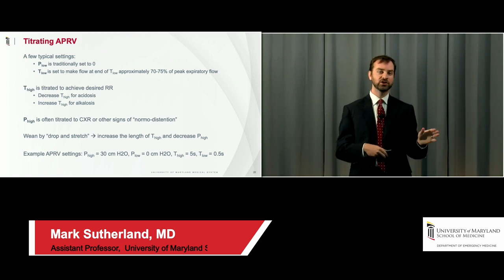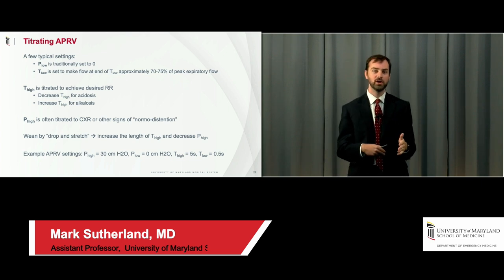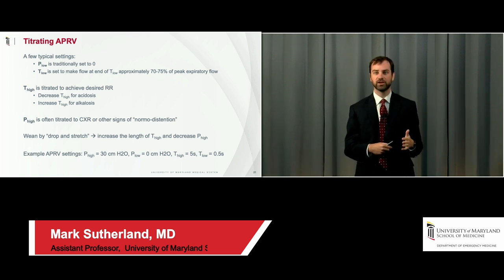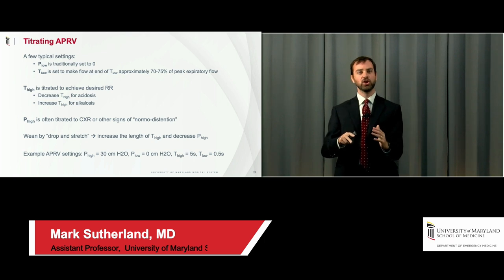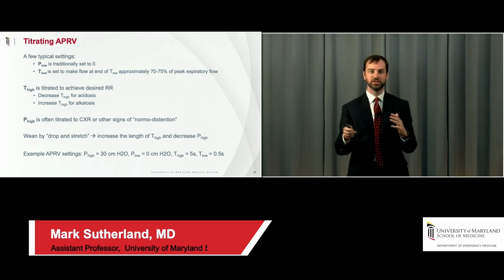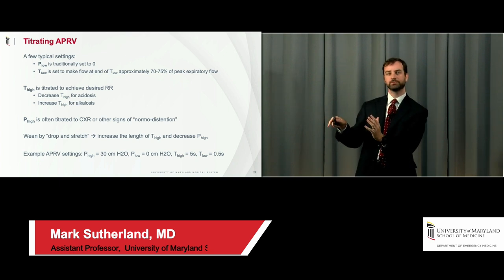T low, I'm actually going to talk a little more on the next slide. T low is typically set to target your flow to be 70 to 75% of your peak expiratory flow at the end of the flow curve. If that doesn't make sense, I'm going to show you a diagram on the next slide, which will help. But T low isn't really titrated based on the patient per se. It's titrated based on your vent waveform. So it's kind of dealt with separately.